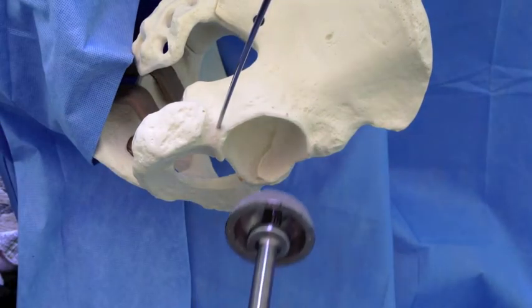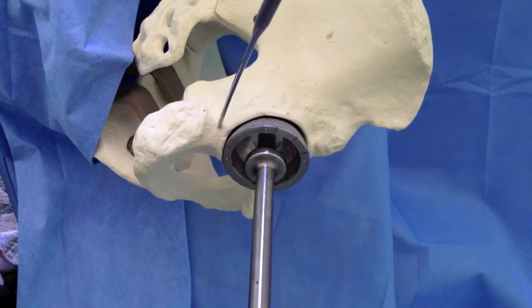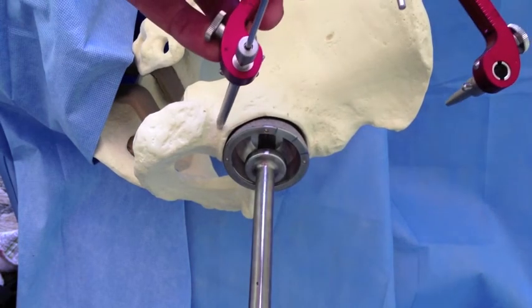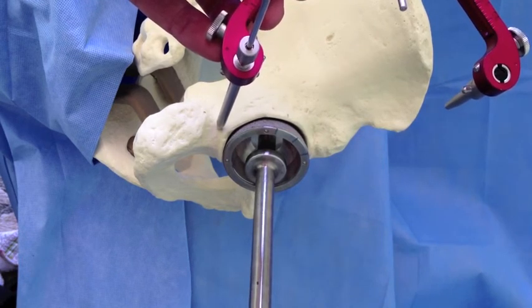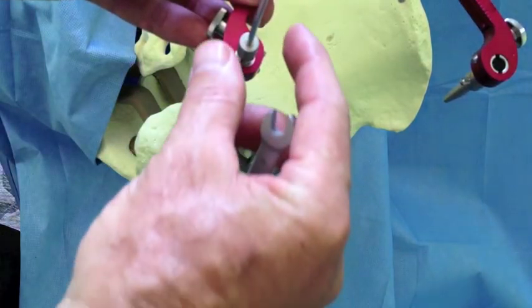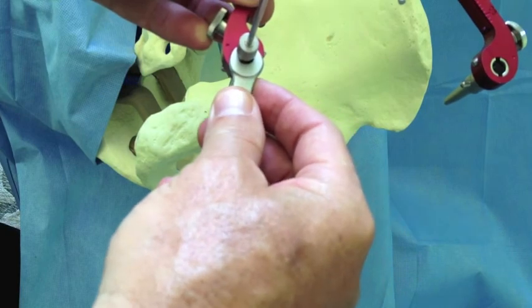Now place the acetabular component into the prepared acetabulum and then slide the HipSextant over the base point pin to dock the base point cannula onto the bone. Again, please be sure that no soft tissue is interposed. Clamp the cannula onto the pin using the 7 millimeter wrench on the collet nut.